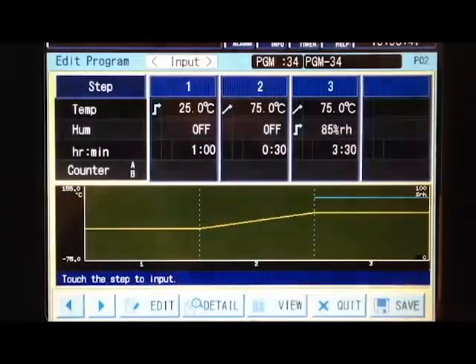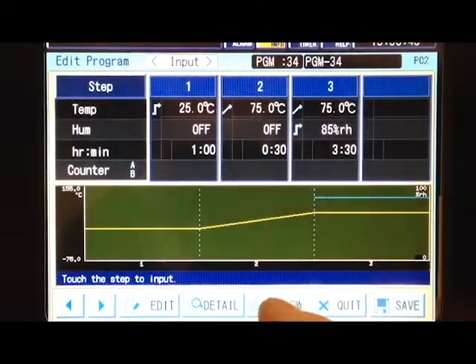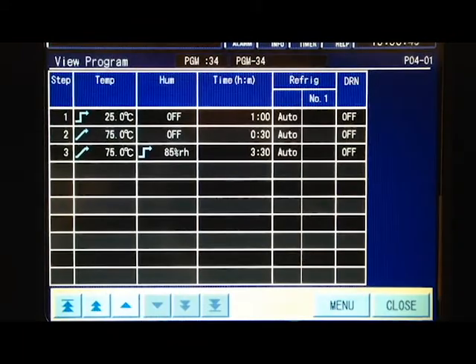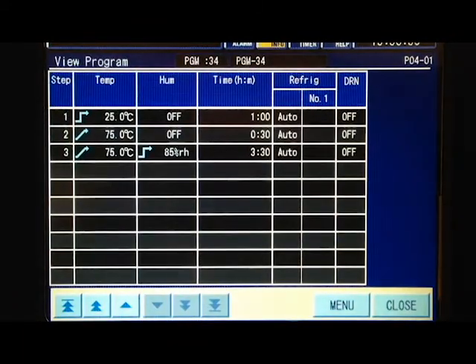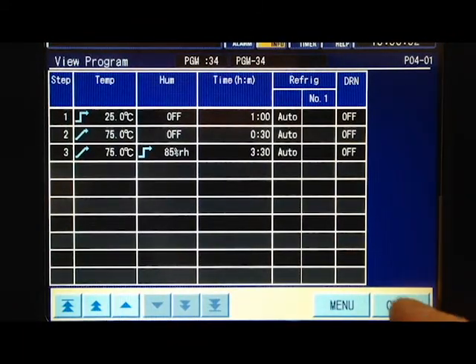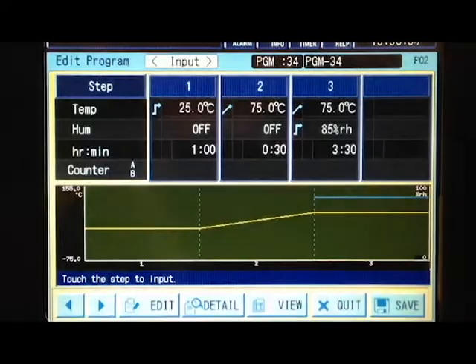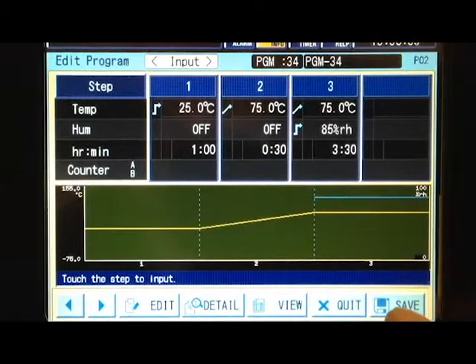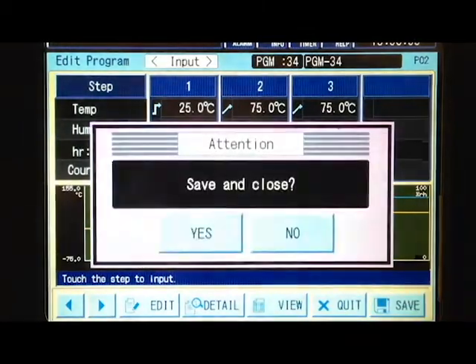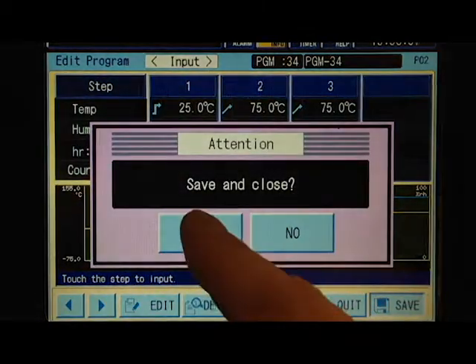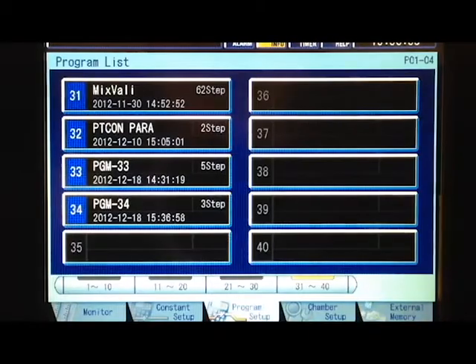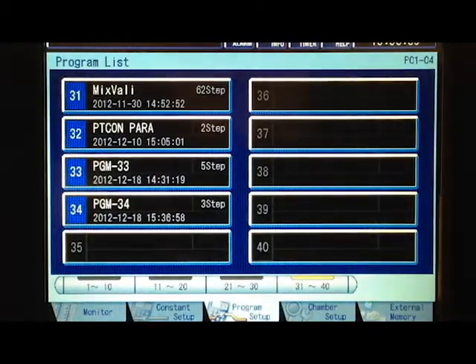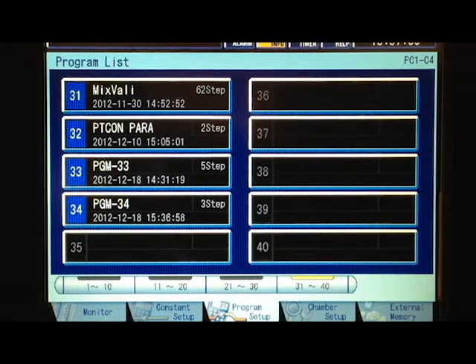Under view, we can see a list of the program, and now we can save the program. There, we've created program number 34.